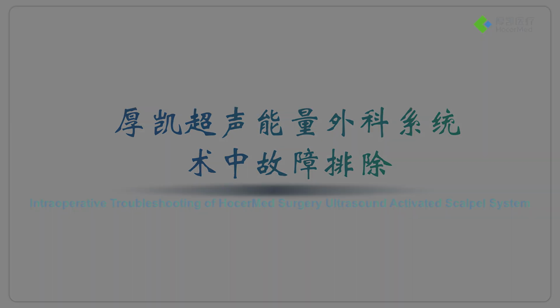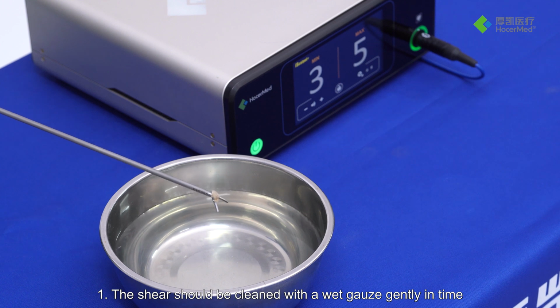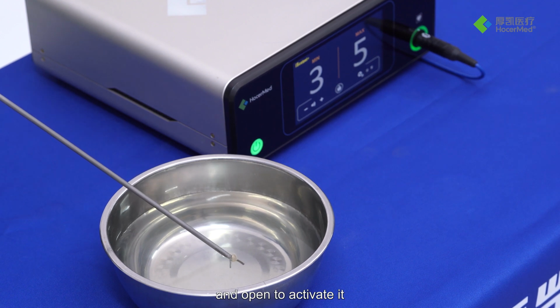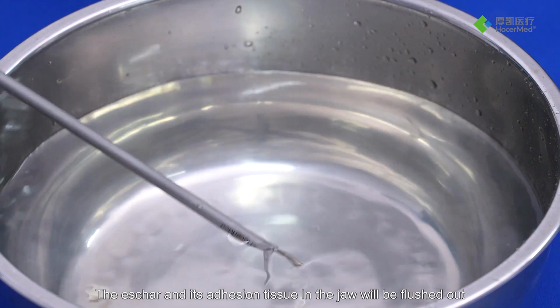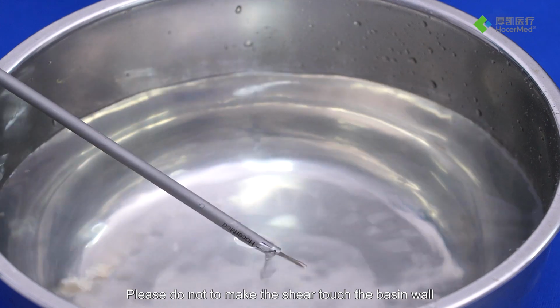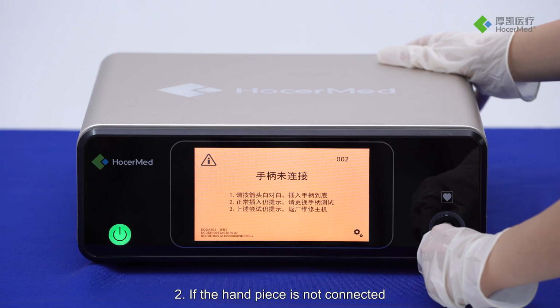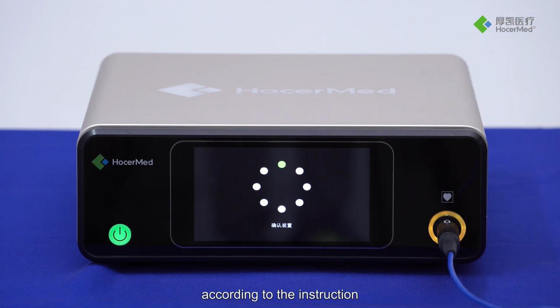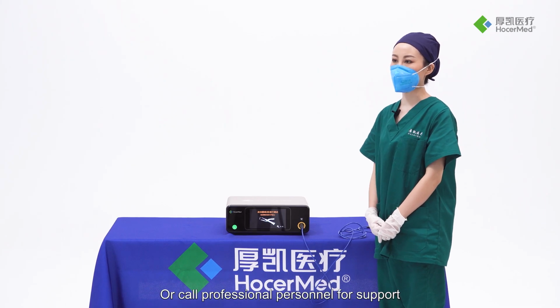Troubleshooting. 1. The shear should be cleaned with a wet gauze gently in time, or place the shear in a stainless steel basin and open to activate it. The eschar and its adhesion tissue in the jaw will be flushed out. Please do not make the shear touch the basin wall. 2. If the handpiece is not connected, it can be reconnected or replaced according to the instruction. Or call professional personnel for support.